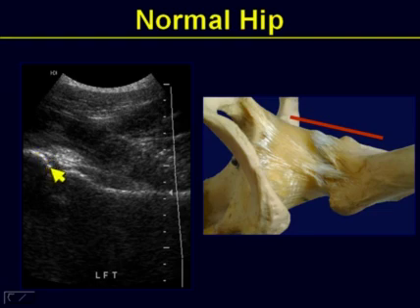Over the acetabulum, with a little bit of hypoechoic hyaline cartilage undercutting, you see the hyperechoic triangle of the acetabular labrum. Continuing inferiorly now, you note that there is the relatively thick capsule, okay? And here you could appreciate the volume of this capsule. Over that, you begin to appreciate the multipennate structure of the iliopsoas muscle.